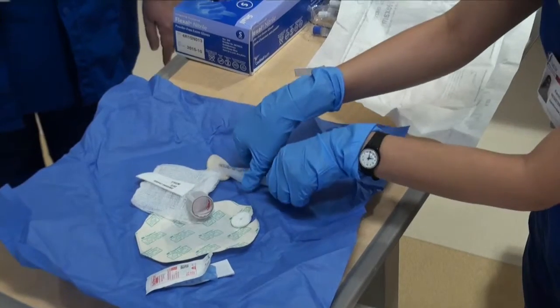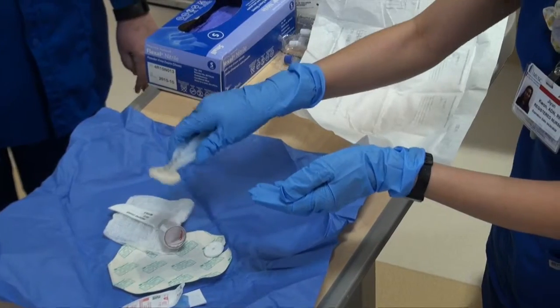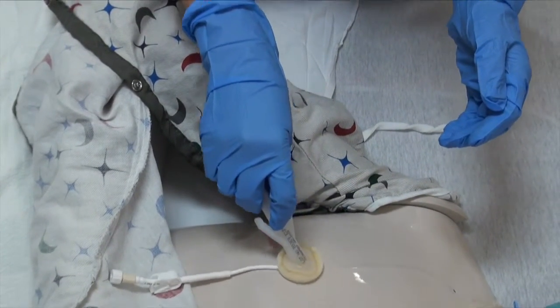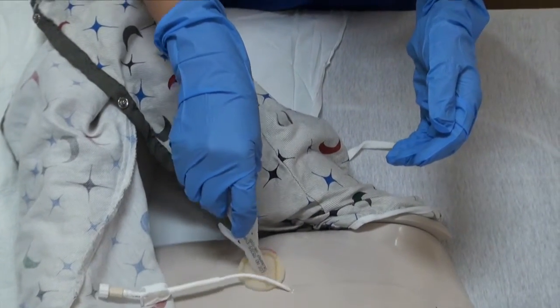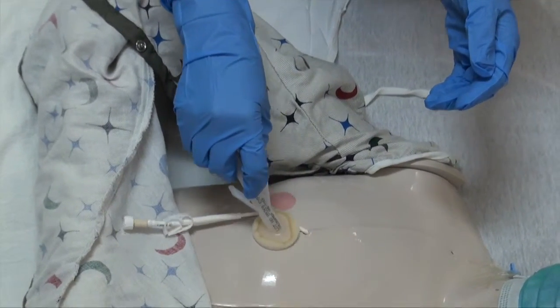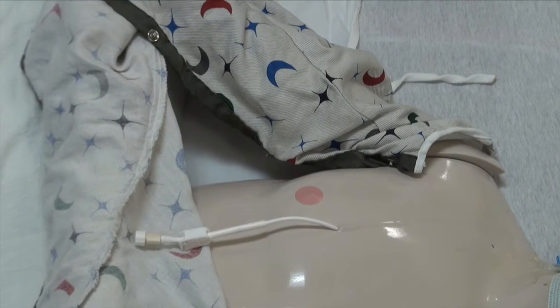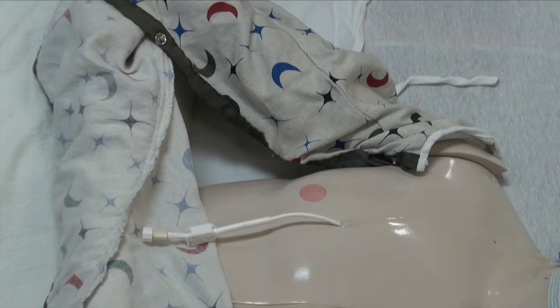Using the CHG swab, you will clean the insertion site and surrounding skin approximately the size of the dressing. Using a back and forth motion, you want to clean for at least 30 seconds to create friction. Let the area dry completely. Do not wave or blow over the insertion site to decrease drying time.